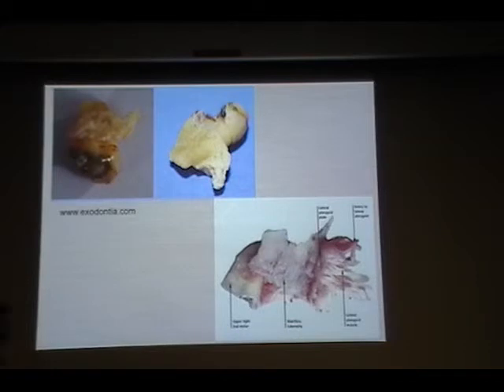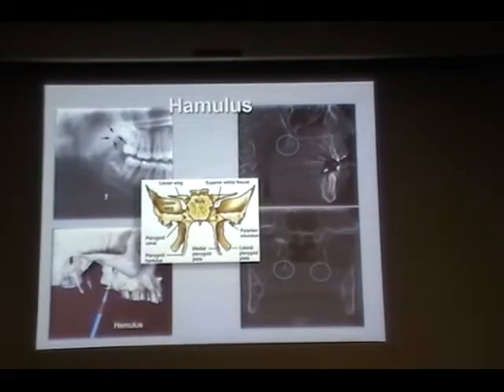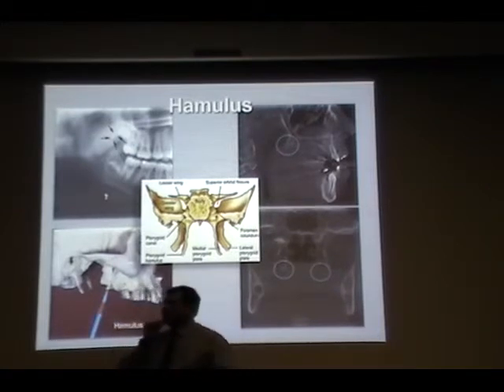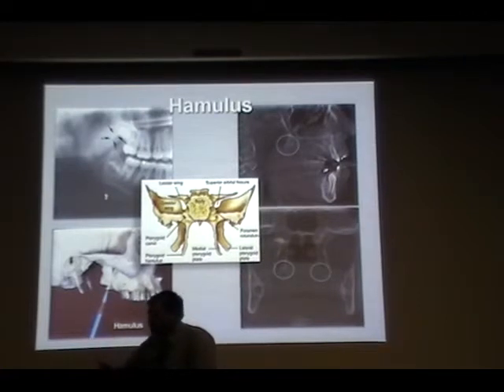So, to answer your question, like here, this band, especially in the canine premolar region, here you are not able to see this portion of the thick cortical plate. If it is less than 3 millimeters, then it is suspicious for osteopenia. Then you would run multiple tests to confirm that. Would that affect your treatment plan for an extraction or dentures? Or does it matter if there's less bone?